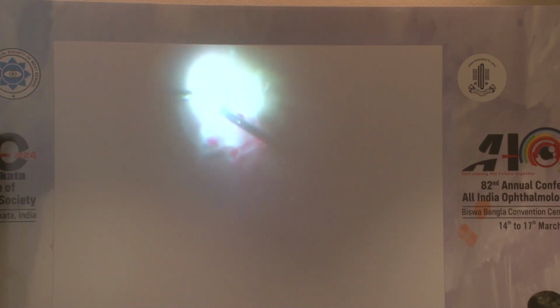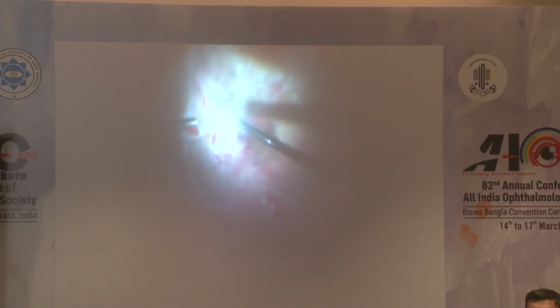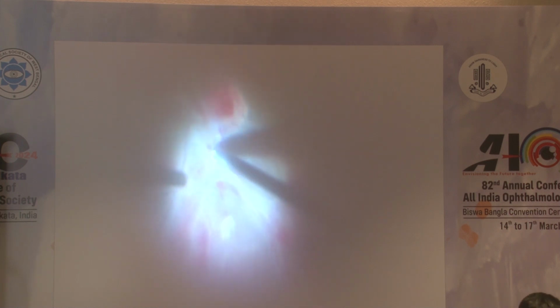We can also see that there are active patches of choroiditis in this area. This whole area now being peeled off, we can easily cut it off with the cutter, and we can see that posteriorly on the retina there is a lot of active vasculitis which can be noticed in this area. Now this case was also done post anti-VEGF. Anti-VEGF was injected 5 days prior in this patient.